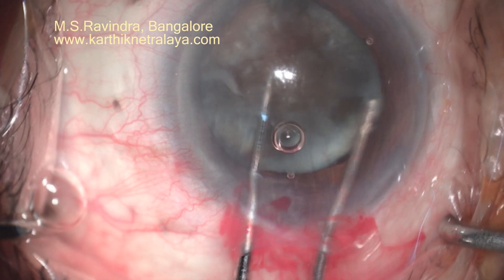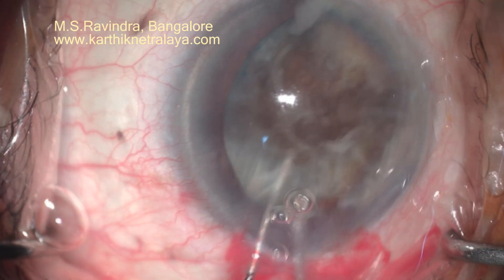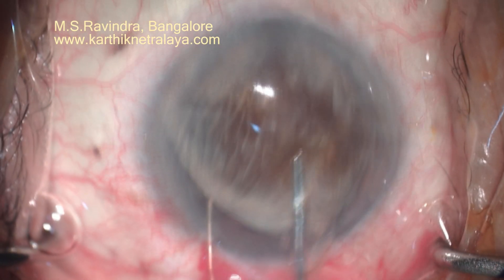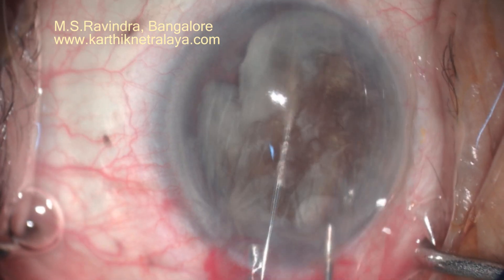The rotation of the nucleus is done bimanually. It was pretty adherent to the capsule, but in spite of that I did not create any additional damage to the zonules, because the pull is on 360 degrees — all the zonules are simultaneously stretched.